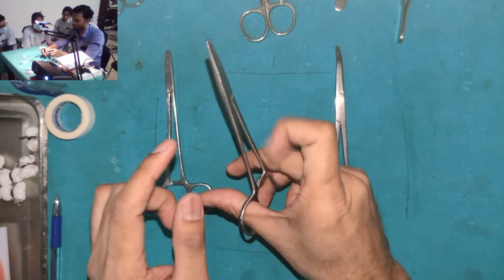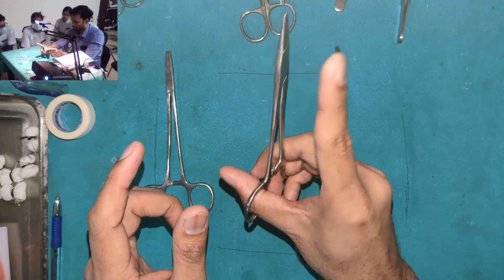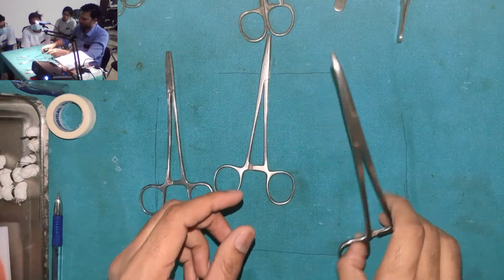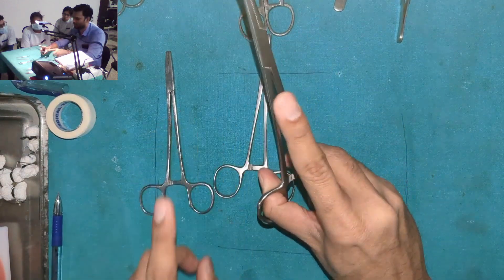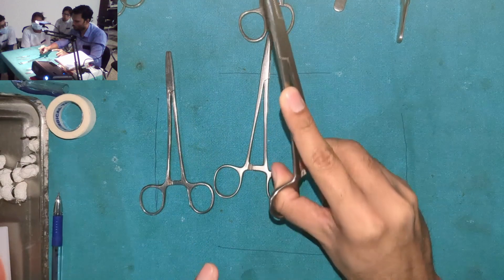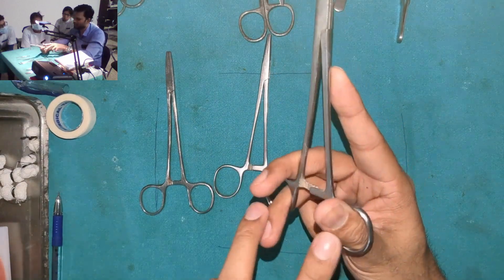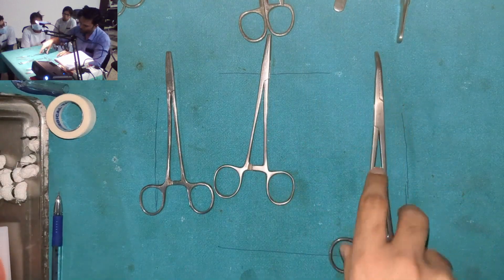Your index finger is going to sit at the hinge. If the instrument is a little longer and your index finger can't reach the hinge, then you can support the shank. This is essentially a three-point grip.